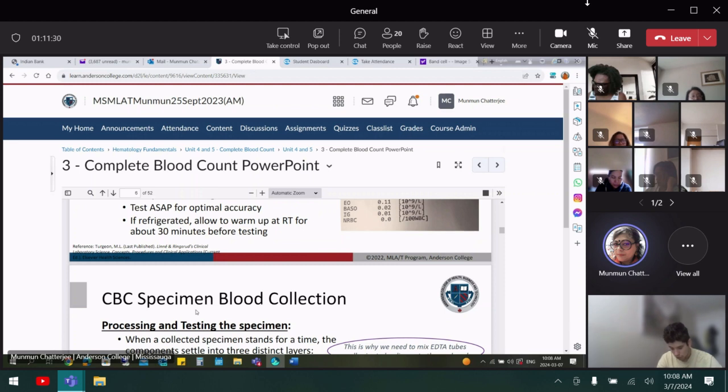Each collection center or core lab or organization has its own LIS system. How they set it up, you have to follow. But the order of draw is not going to change all over the world. If they say that you have to collect the electrolytes in the SST tube, it's not that you can collect the SST after the lavender. Whatever tubes you are going to use, after selecting the tubes, you have to follow the order of draw. Everybody is clear? Understand?